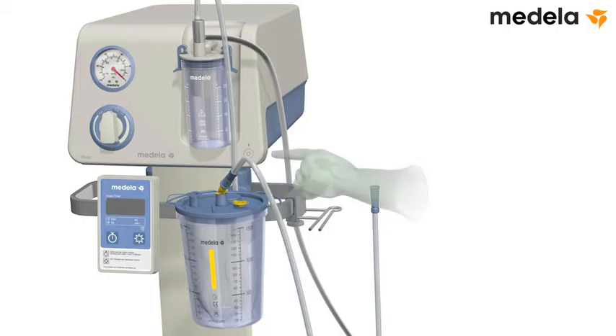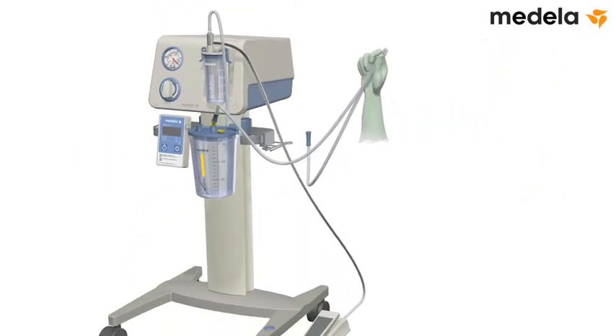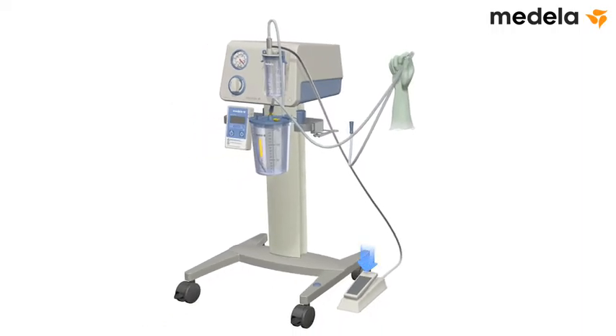To test the vacuum, turn on the pump and clamp the sterile tubing with your thumb and forefinger. Fully depress the foot-controlled vacuum regulator — press forward and down using the ball of your foot.